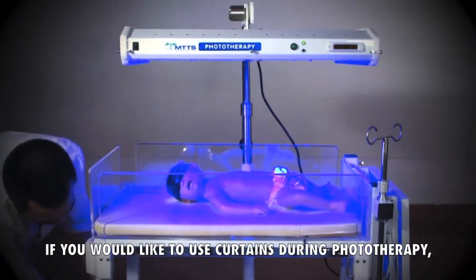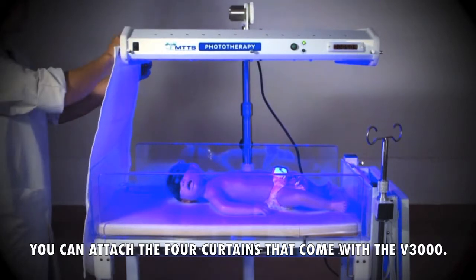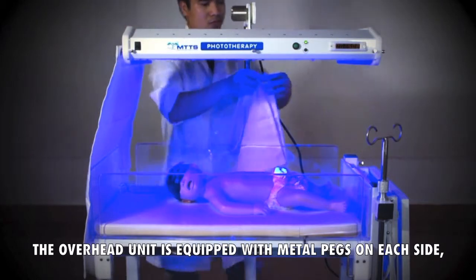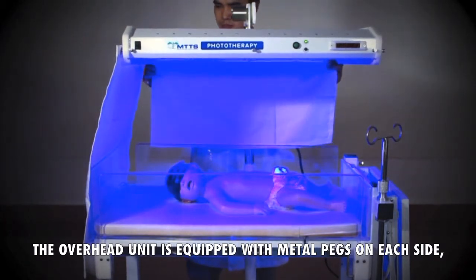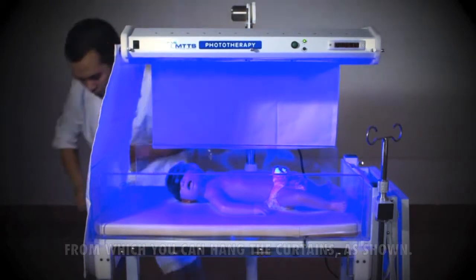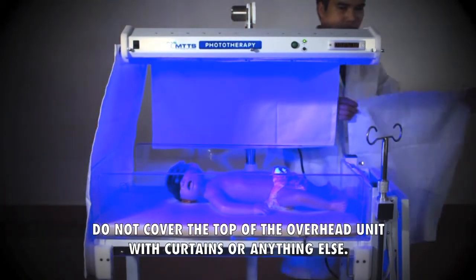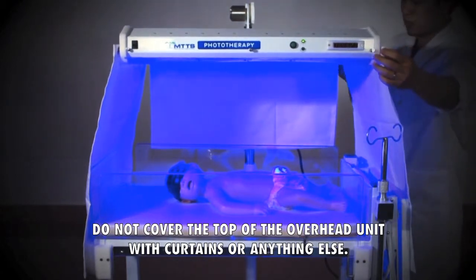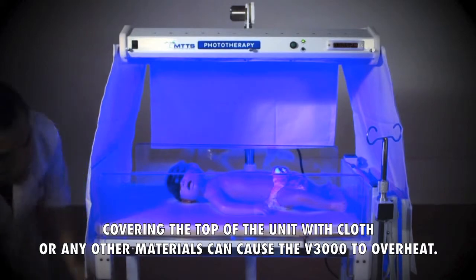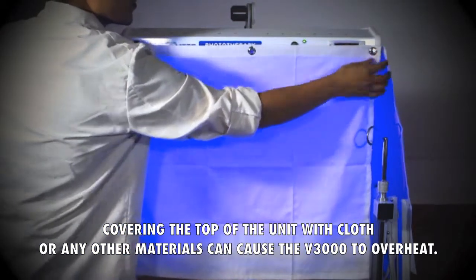If you would like to use curtains during phototherapy, you can attach the four curtains that come with the V3000. The overhead unit is equipped with metal pegs on each side from which you can hang the curtains. Do not cover the top of the overhead unit with curtains or anything else. Covering the top of the unit with cloth or any other materials can cause the V3000 to overheat.